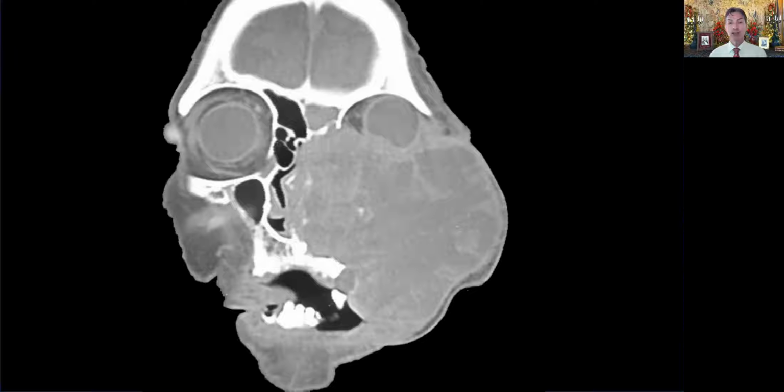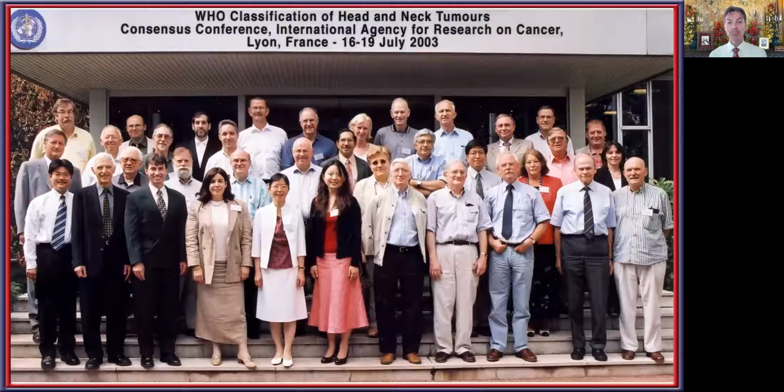And so many times when I approach these lesions, for me, the gross is actually the imaging. When I look at a core needle biopsy of a salivary gland tumor and then review the imaging findings, even if it's just the imaging report, here I am showing you the image because I think it's much more dramatic than reading through a very long, detailed description of what they're seeing radiographically. But if you see that each of them talks about bone destruction or compartment destruction or expansion into adjacent structures, this really is something that can be used to help you in your overall diagnostic interpretation.